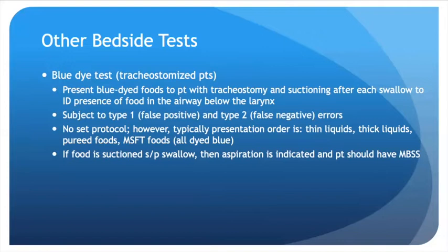There is no set protocol for a blue dye test. However, typically the presentation order is thin liquids, thick liquids, puree foods, and then mechanical soft foods. And these are, of course, all dyed blue. And if food is suctioned after a swallow, then you assume that aspiration has occurred and then refer out for a modified Barium swallow study.